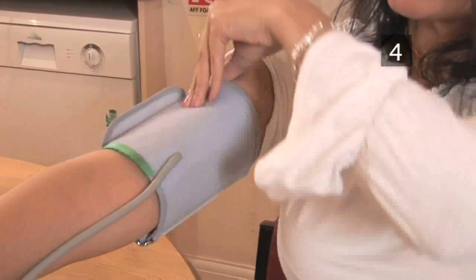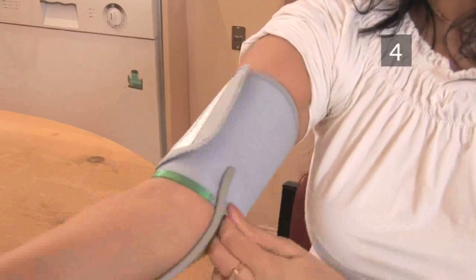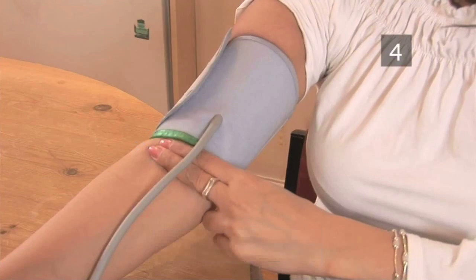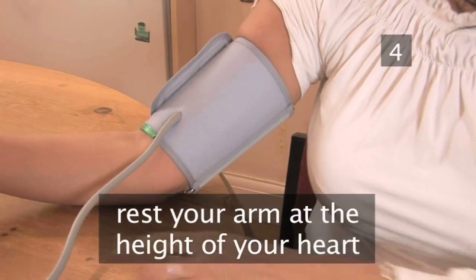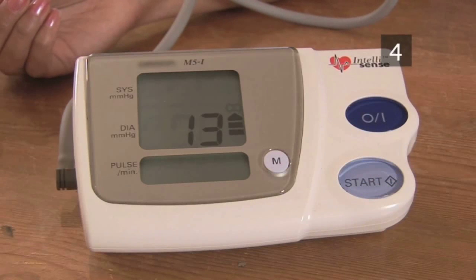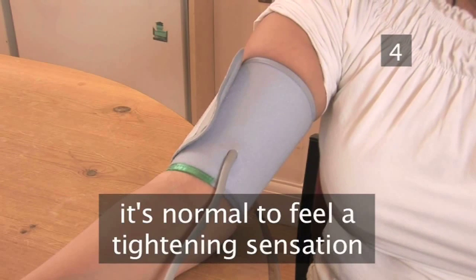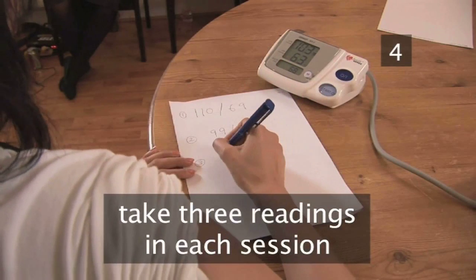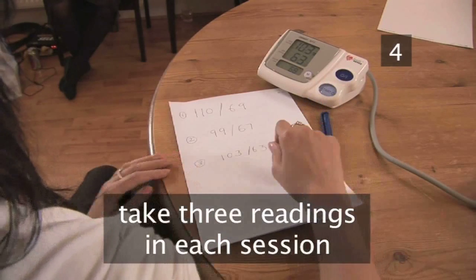The bladder — the part which inflates — should cover at least two thirds of the distance around your arm and should not overlap. The bottom of the cuff should be about 2cm from the crease in your elbow, and you should be able to fit one finger between the cuff and your arm when it's fastened. Rest your arm at the height of your heart and turn the monitor on. It will automatically inflate the cuff. It's normal to feel a tightening sensation. When the display on the monitor sets, record your reading. Readings can vary, so it's a good idea to take up to three readings in one sitting and record them all for your doctor to look at.